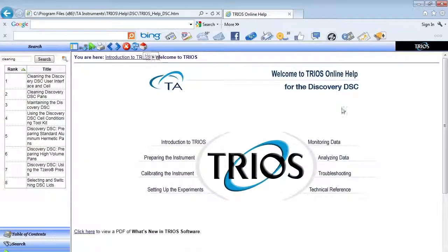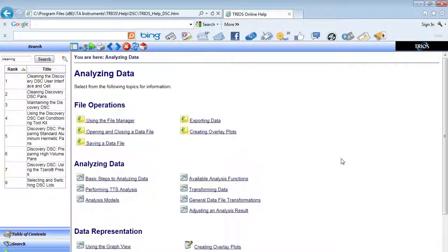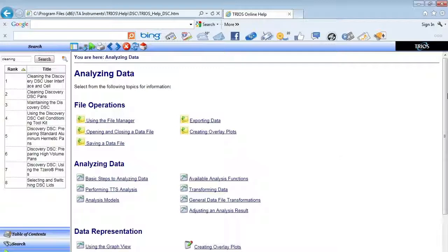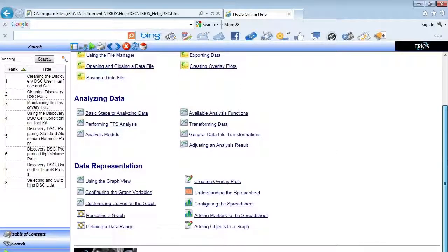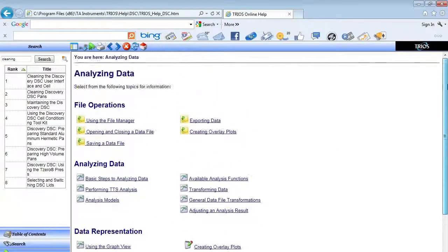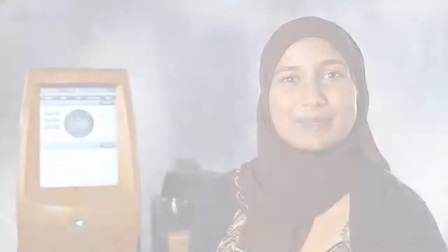Further information regarding data analysis and data representation can also be found in the help topics. With these tools and some practice, you are on your way to becoming a TRIOS expert.